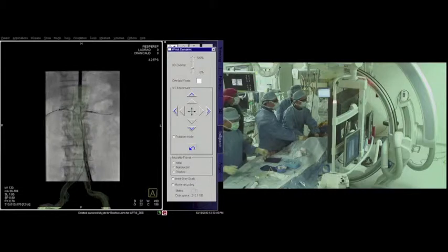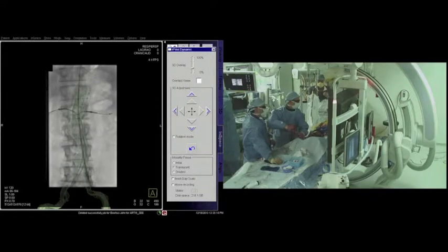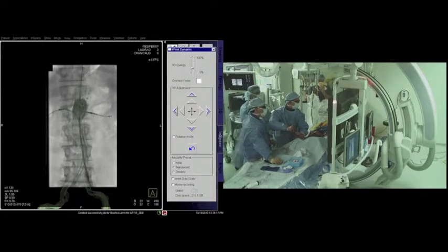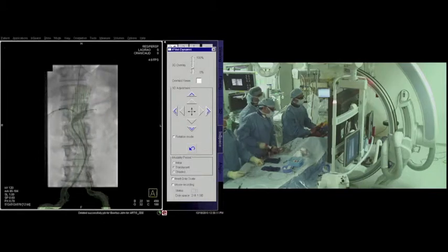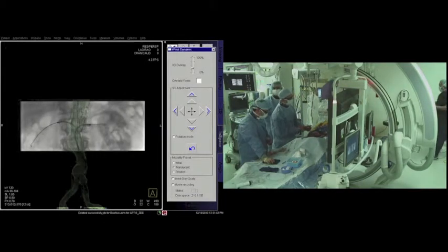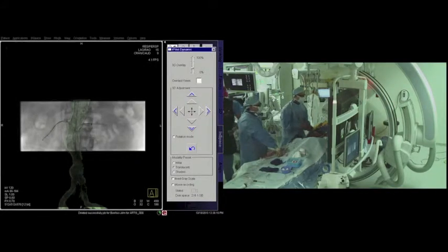We then position a balloon expandable stent graft in each target artery, remove the diameter reducing ties, and deploy the bare stent at the superior aspect of this device. At this point, we use a Coda balloon to approximate the proximal seal zone. Each renal artery bridging stent graft is then deployed with approximately 4 millimeters of stent graft extending into the fenestrated device. We then flare the proximal stent graft with a 10x2 angioplasty balloon. We now perform bilateral renal arteriograms with a total of 4 cc's of contrast to confirm seal at the fenestration and intact renal artery perfusion.